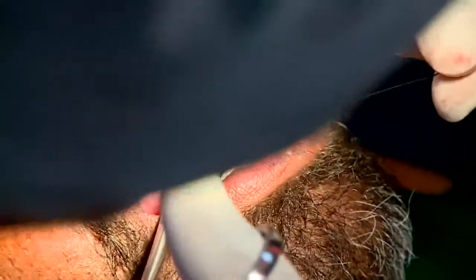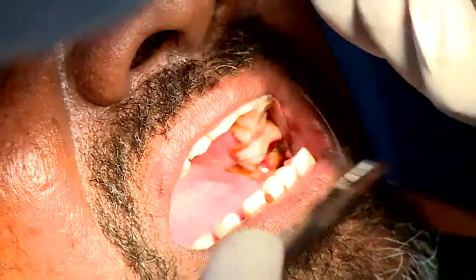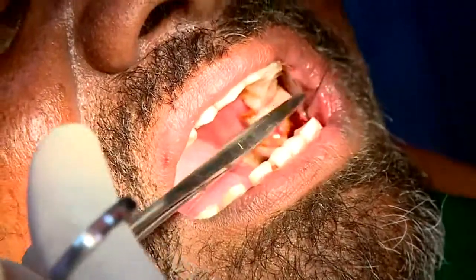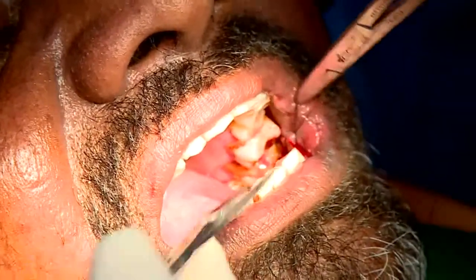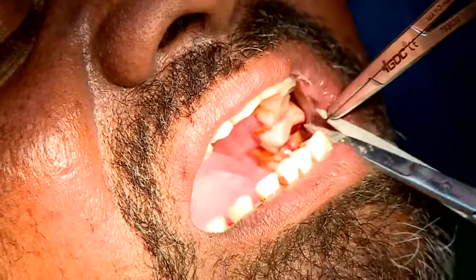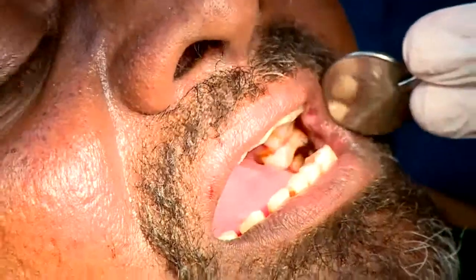So as we are suturing, let me ask one more question. How much formalin are you going to take for this tissue? Is there any ratio? For one part of tissue, your fixative should be 15 to 20 times more. Right, so 1 is to 15 or 20. That should be the volume of fixative for adequate fixation.